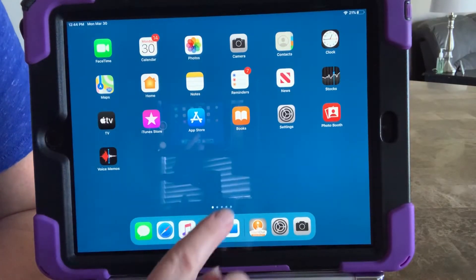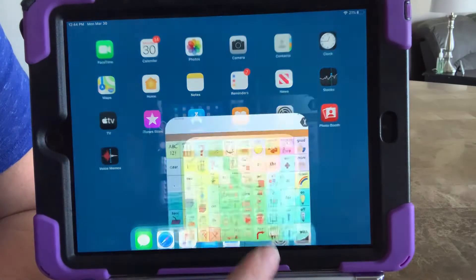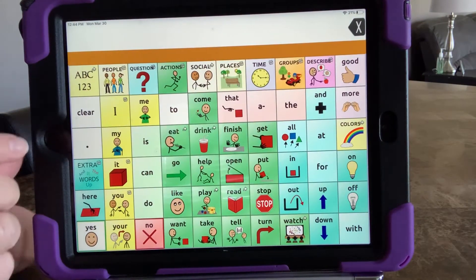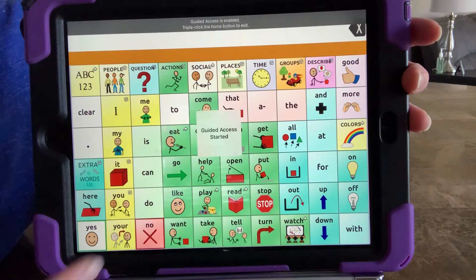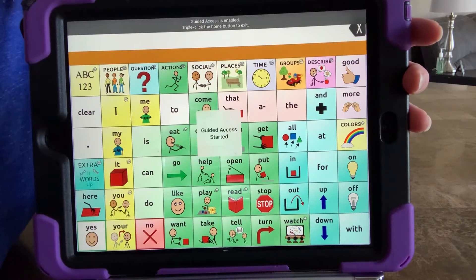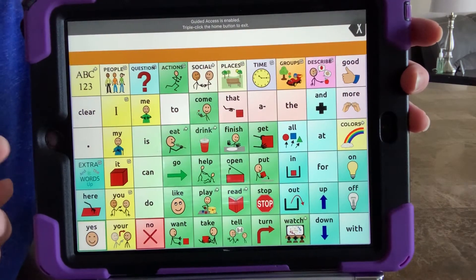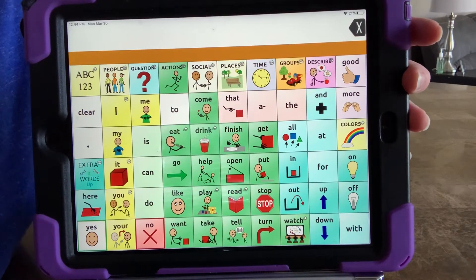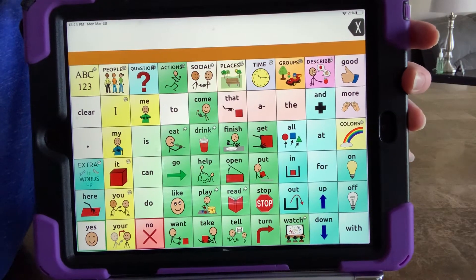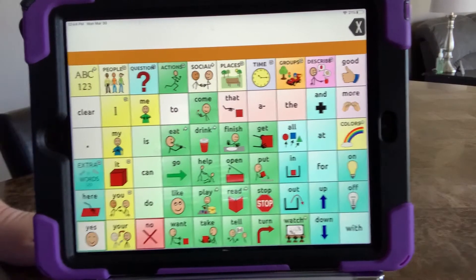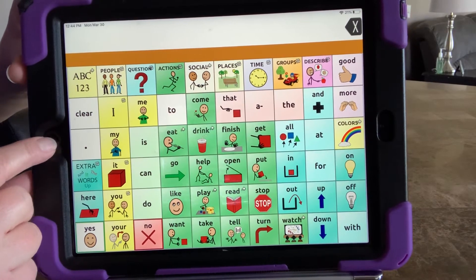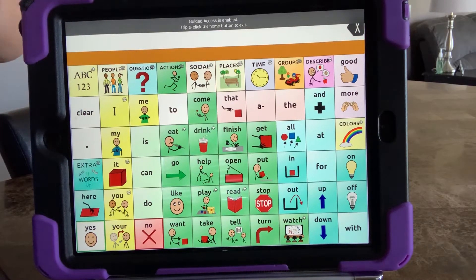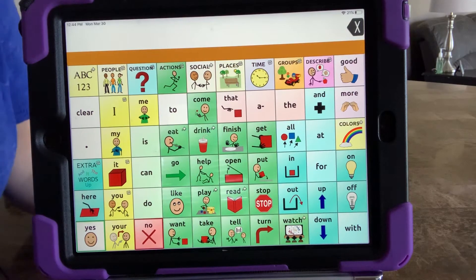We want to find our app — I'm going to go into TouchChat — and now when I triple-click three times really fast it goes into guided access. Sometimes that takes some practice to get used to, but you can do it. Now we're locked into the app, so if the child or individual tries to get out using the home button, they'll get a message up here saying they're unable to do so.